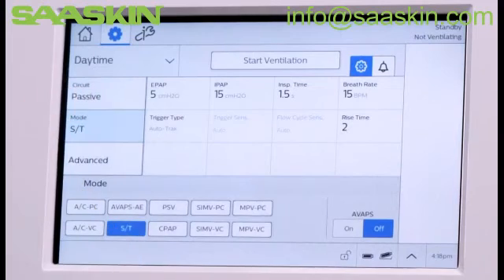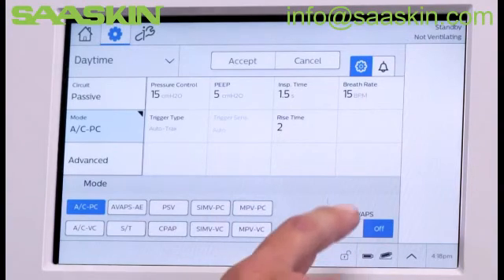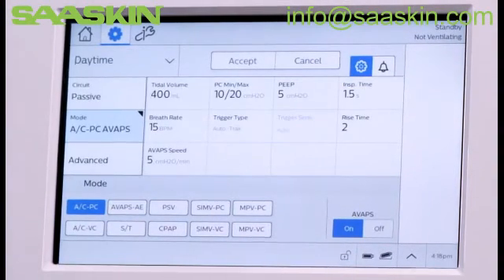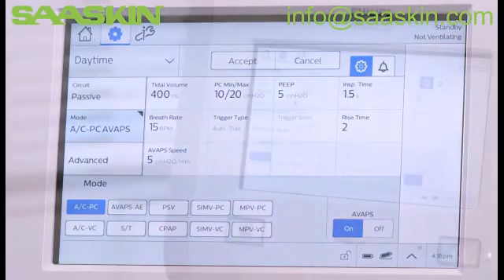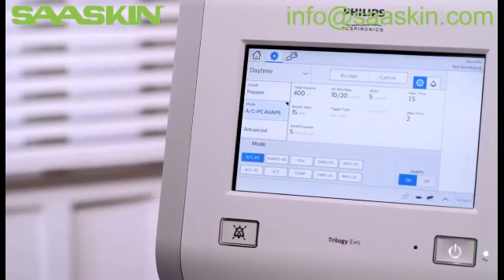Next, tap Mode and choose the desired ventilation option. In this example, we'll select ACPC mode, which stands for Assist Control, Pressure Control, with AVAPS on. Note the AVAPS on-off option beside the modes. AVAPS is available in the ST, PSV, and ACPC modes.